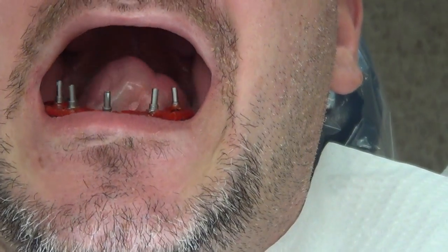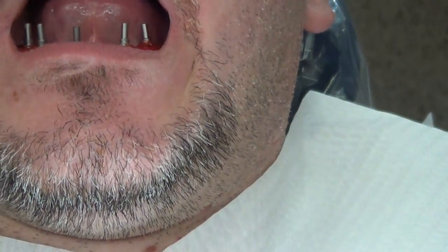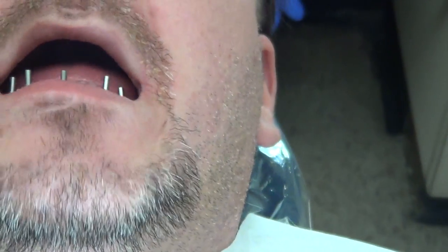What that does is lock in the positioning of the implants so that when I take the impression, I'm going to pick this whole bar up. It's going to be embedded in the impression. And when I pour up the model, that's supposed to be an exact position — that's what we build the bar on.